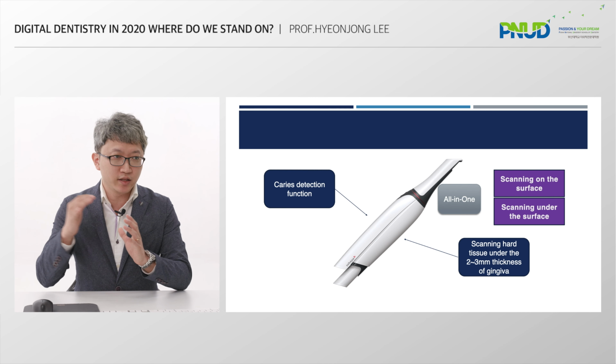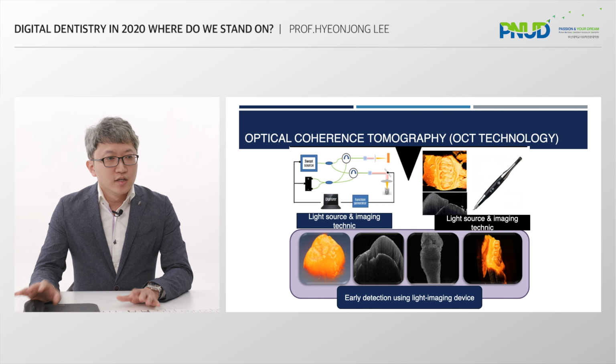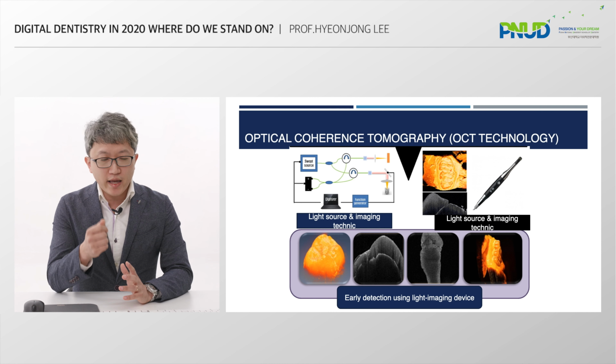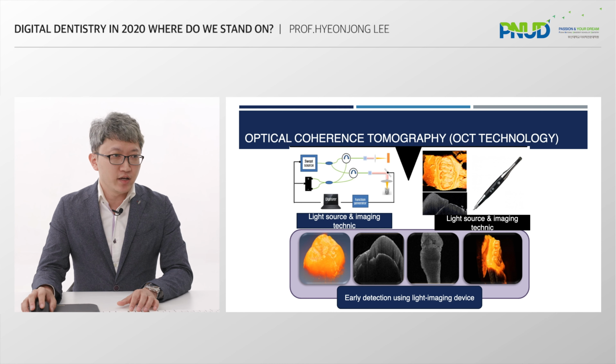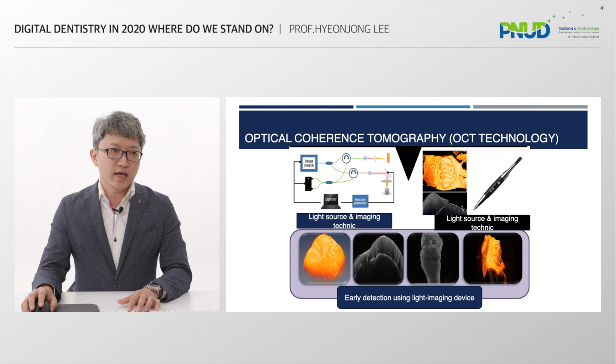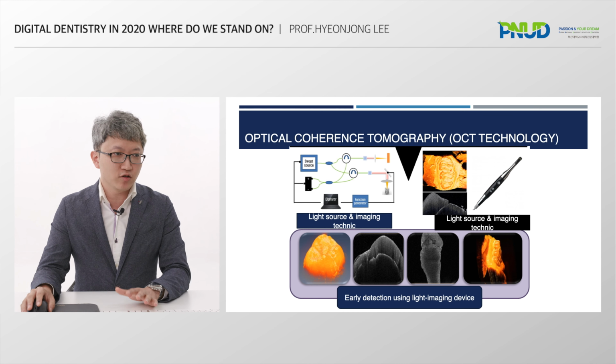Someday it will be integrated in one scanner. The OCT I mentioned above means optical coherence tomography. So maybe after a few years, we may not need to take an X-ray. With standard X-ray we can only see a 2D image of the inside of bone or tooth structure.